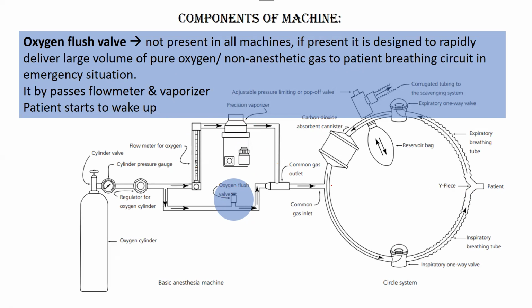But let's suppose you see that your patient is getting into a deep anesthetic plane, or deep anesthesia stage, or not only in that situation, even if your patient is about to die and you think you should stop your surgery there, and you want to stop the gaseous anesthesia and you want your patient to receive only and only pure oxygen gas.